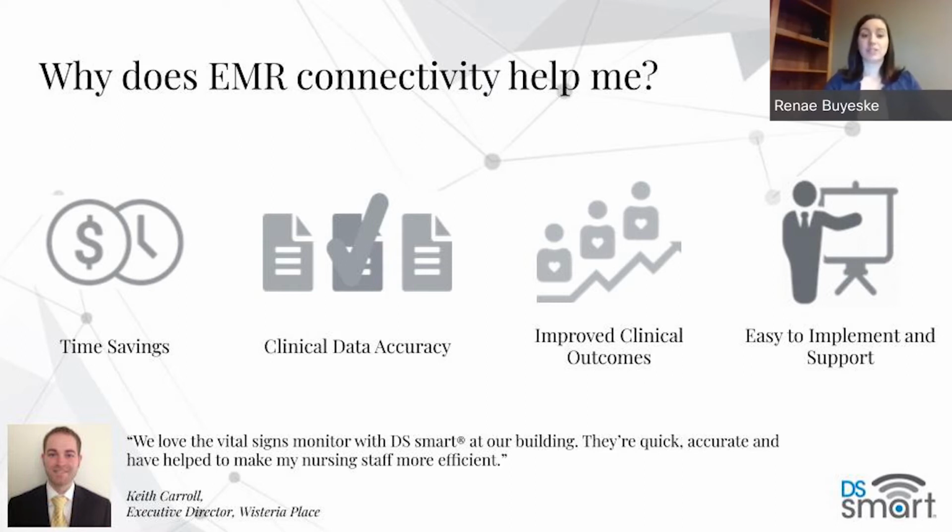During COVID-19, we see that that's more important now than ever because physicians are asking for real-time data and being able to grab that information and say what really truly was the reading in the morning when we went through and took those vitals, afternoon, mid-afternoon, so on and so forth. And we are able to grab and drop that information in, and they can see as the day is progressing how those vitals are benchmarking and comparing to each other to monitor that health remotely by being able to simply log in the EMR and see that information in there.